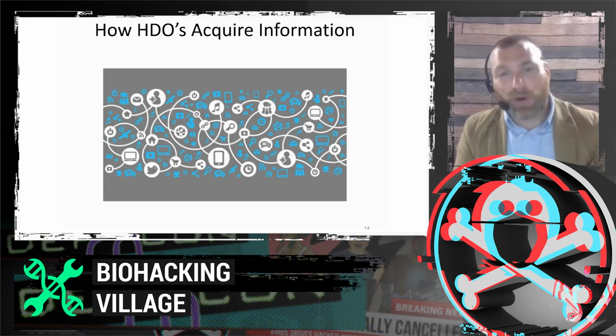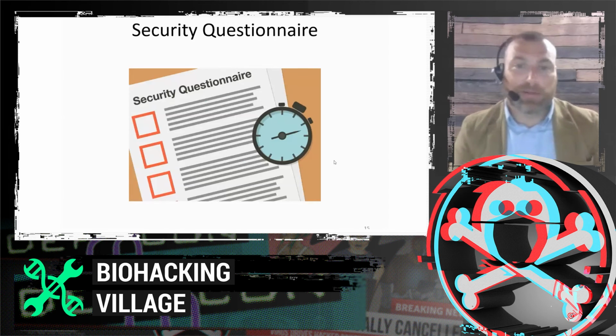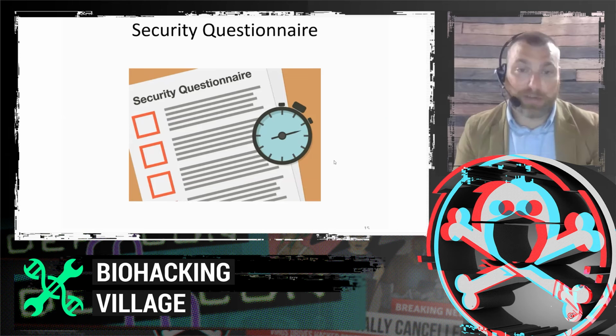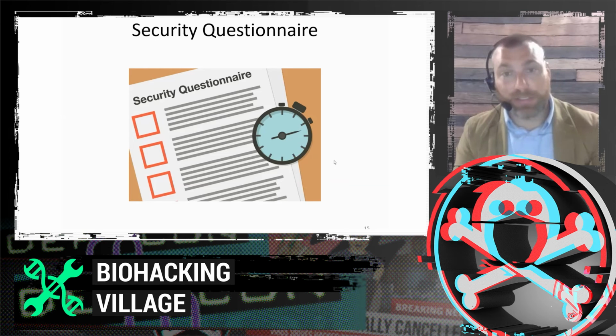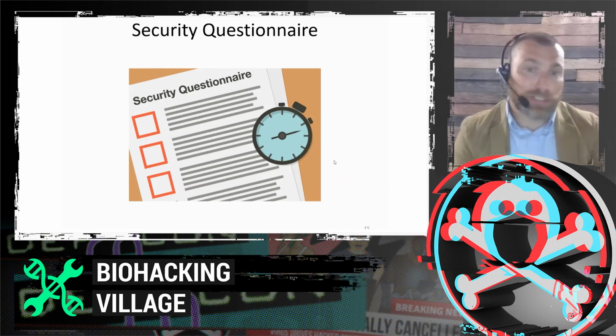So how do HDOs acquire this information? It's pretty common. What they're largely doing is sending us security questionnaires, and most medical device manufacturers are receiving hundreds of these from US customers each year. They're extremely lengthy, extremely detailed questions.